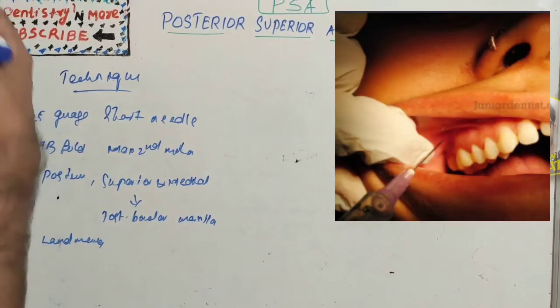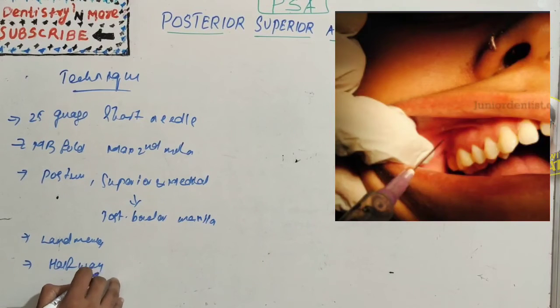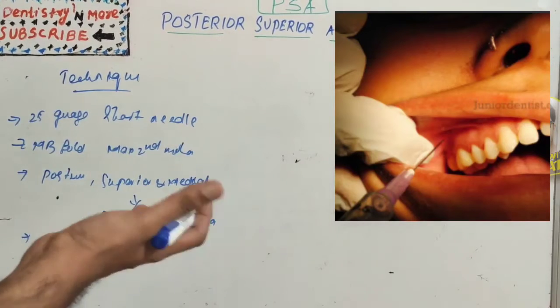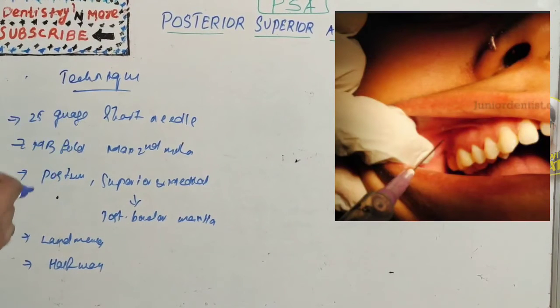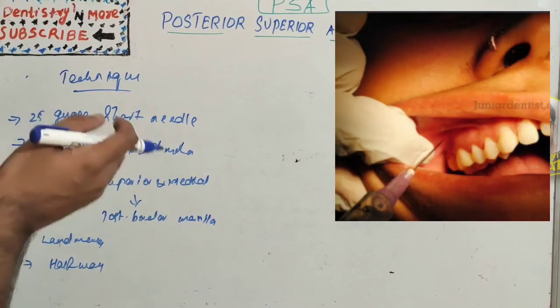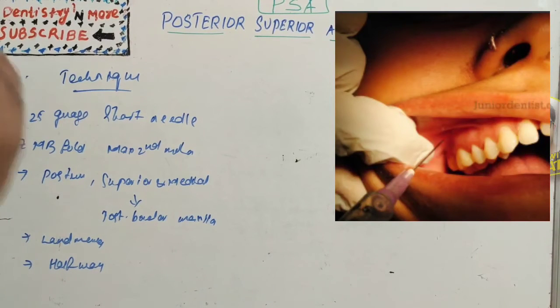And we should have the patient open their mouth only halfway, not completely, because it creates more room for the injection. Then retract the patient's cheek with mirror, pull the tissues at the injection site very taut, then orient the bevel towards the bone, insert the needle at height of the mucobuccal fold over the second maxillary molar, advance the needle upward, inward and backward.